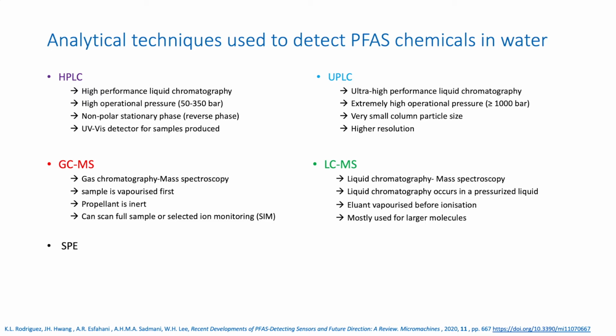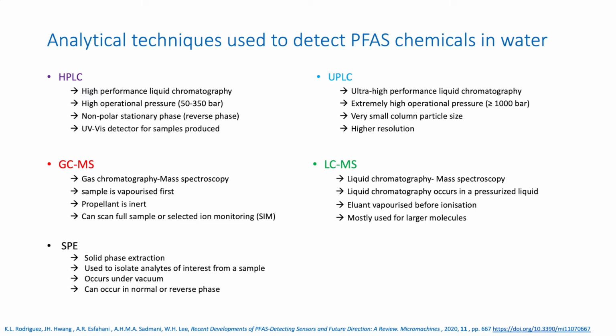The final technique is SPE, or solid phase extraction, which is used to isolate analytes of interest from a sample or concentrate them more. It occurs under vacuum, and it can occur in normal or reverse phase.